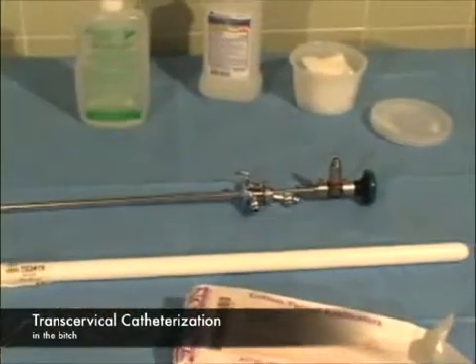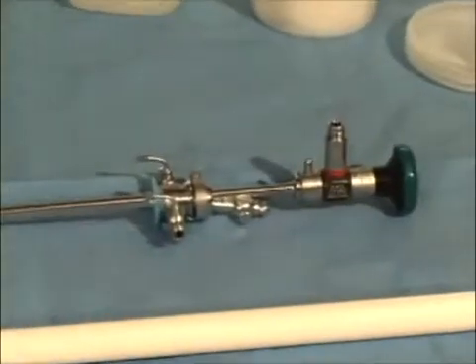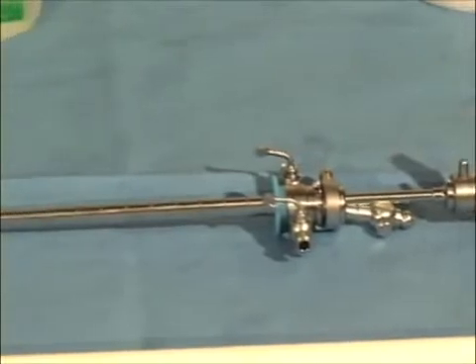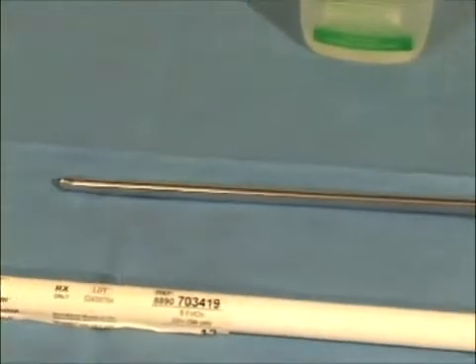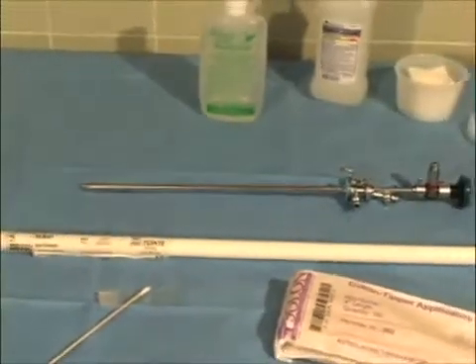Transcervical catheterization, permitting intrauterine insemination, requires specialized equipment: a rigid vaginoscope, also known as a cystourethroscope. Standard polypropylene urinary catheters are actually used to enter the uterine lumen.